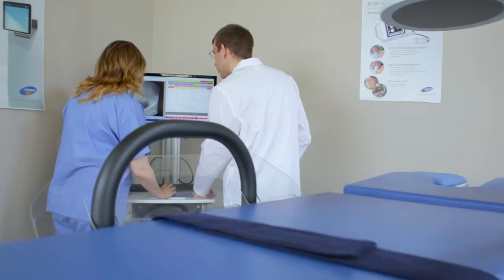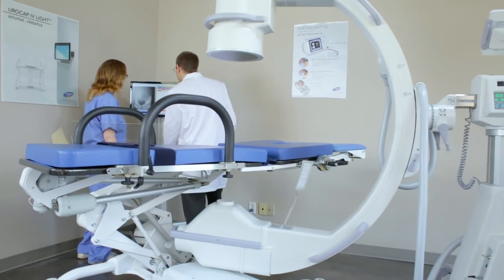The 6210 Video Fluoroscopy Table. Positioned to be the best.